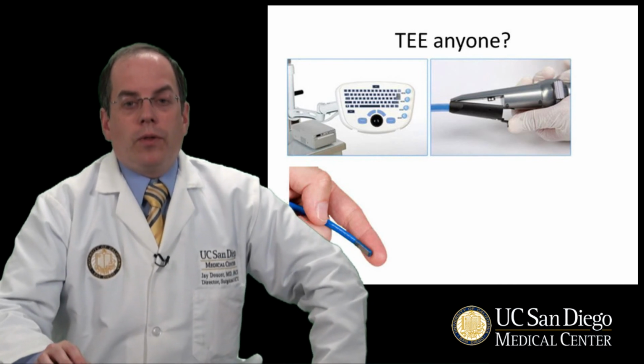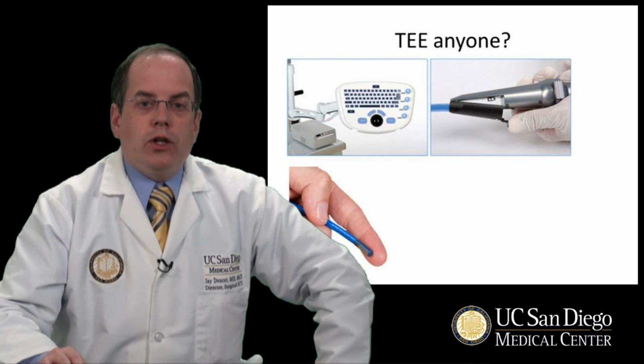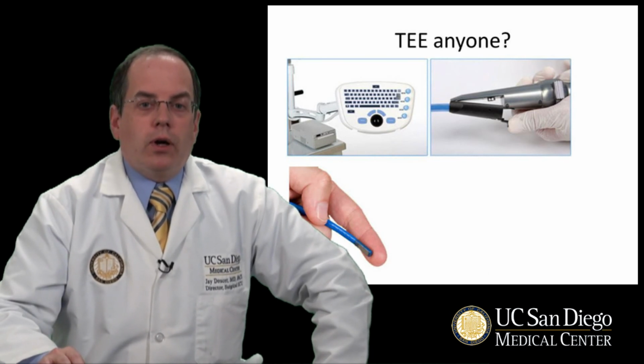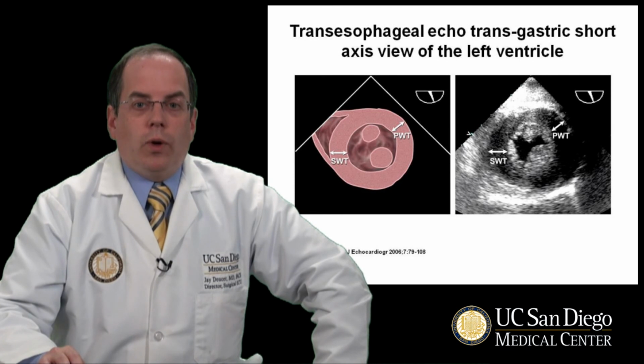Here's an example of what this looks like. The machine actually is using the short axis view through the stomach, and it's possible over time to actually see the ejection fraction and cardiac contractility, cardiac filling, cardiac performance. Here's another view of what that window looks like, and you can also see the left ventricle shows up quite well.